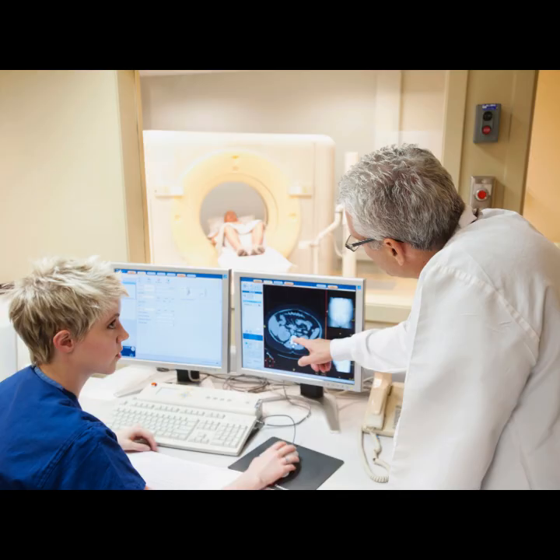Well, we both certainly share the same goal: maximizing image quality and speed, using gradient fields to encode spatial frequency information into k-space. The fundamental debate, however, it seems, remains open. Is stability derived from classical, simple implementation and physical compensation the true path to long-term clinical success?